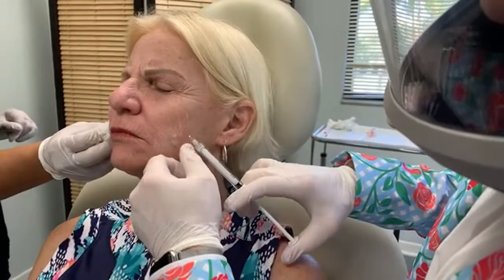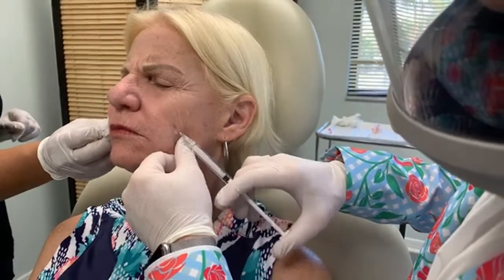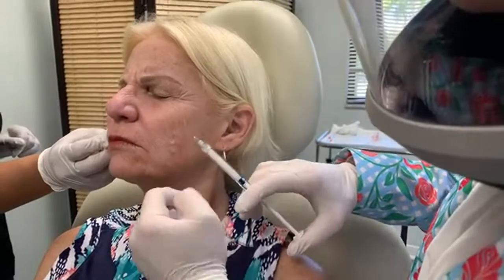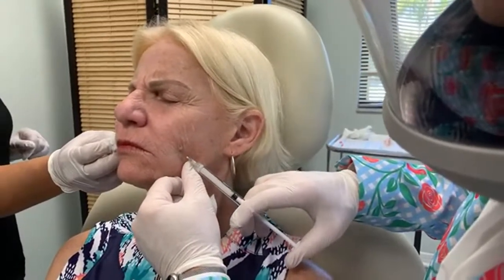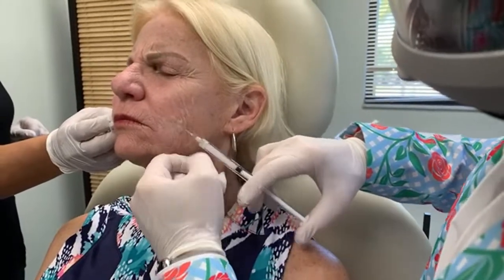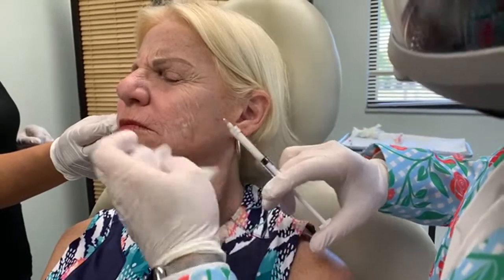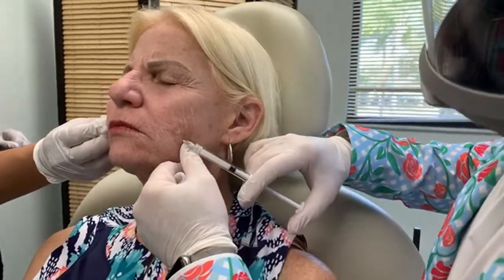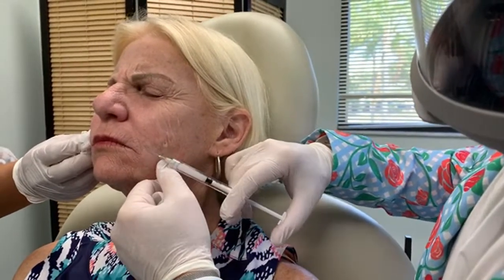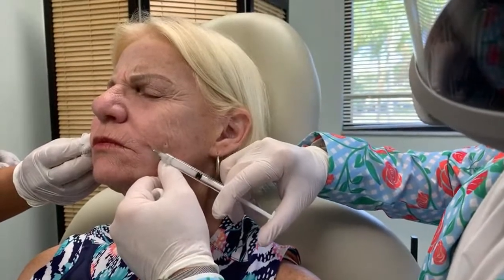So this is very much artistry, right? You can't make things perfect. A little pinch. Some of this is going to go intradermal. Some of it will go a little bit subcutaneous, but all of it helps. And when I do the shiver, that allows me to put a very tiny amount of filler over a large area. When you're injecting intradermally, you need a little extra pressure because it's tougher. She feels a little pinch there, so we're going to numb it with some numbing medicine.